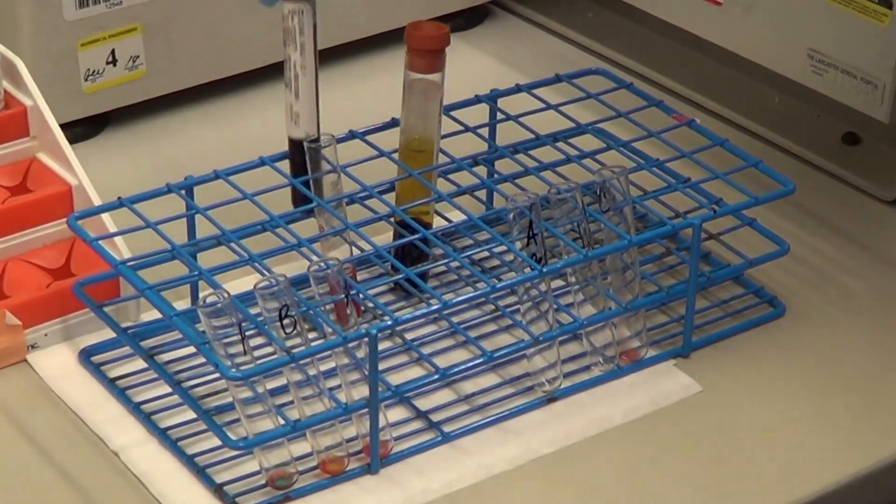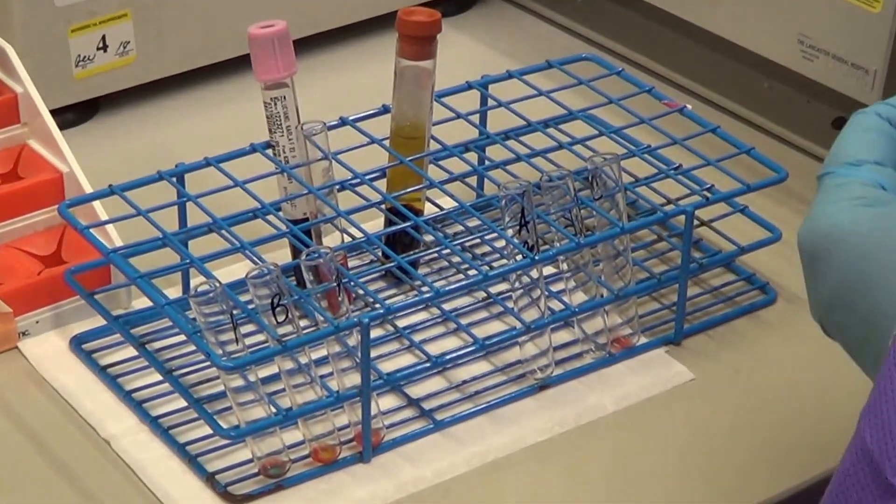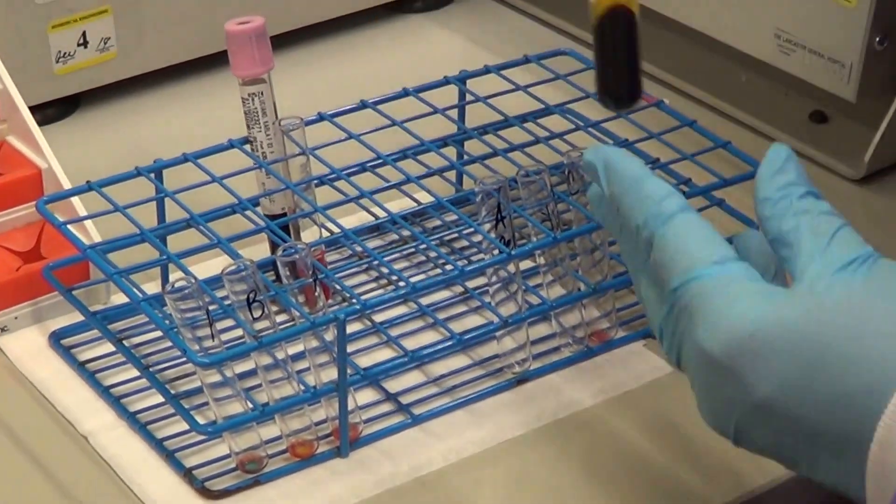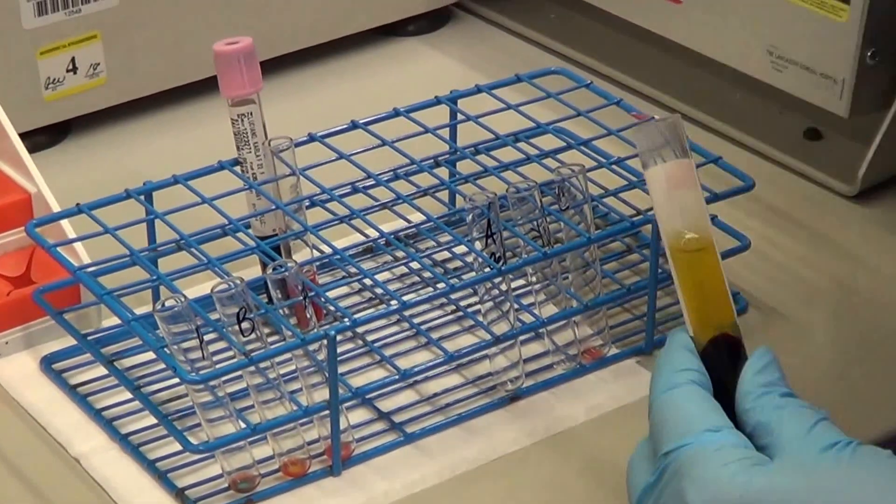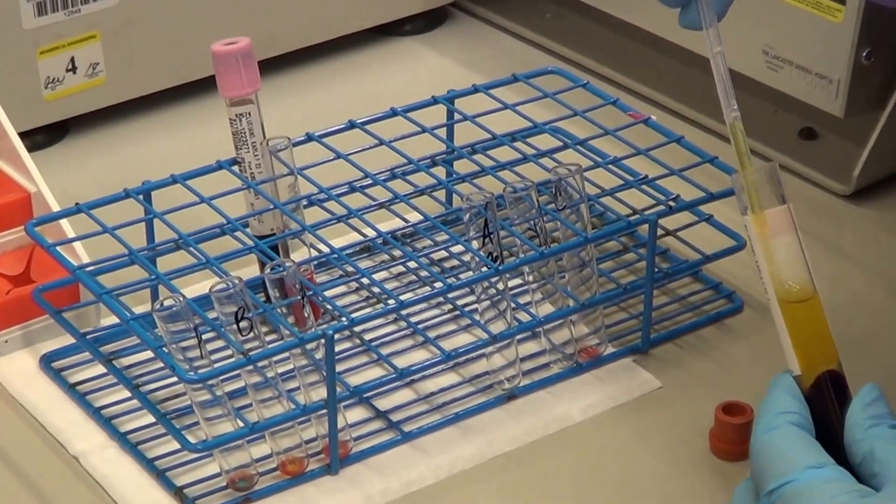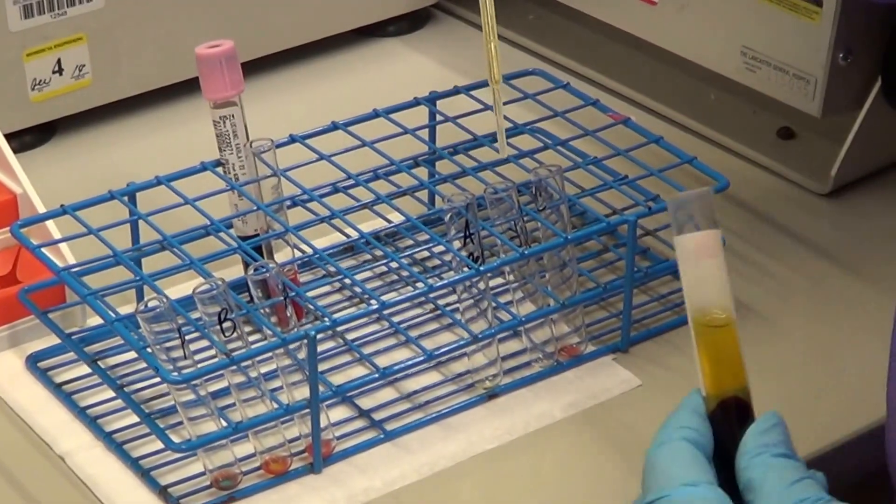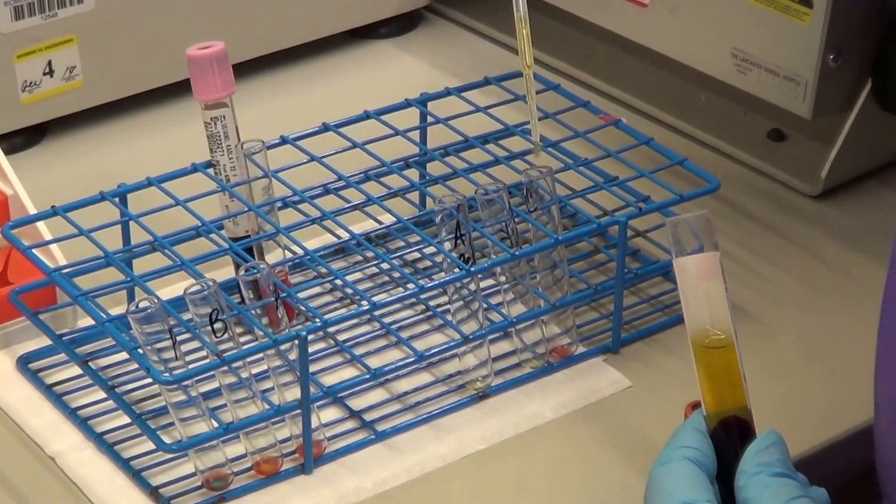The next step is to add two drops of your patient's serum to your reverse typing test tube. This is to confirm what you get for your blood type. You add two drops to each back type tube.